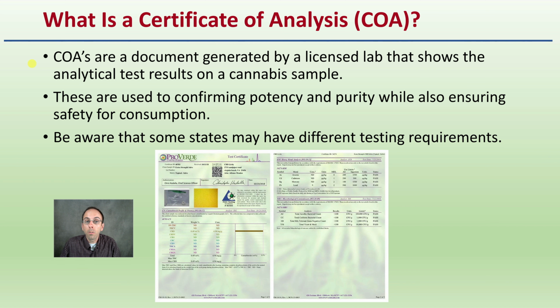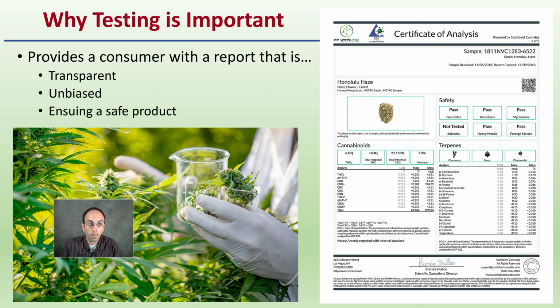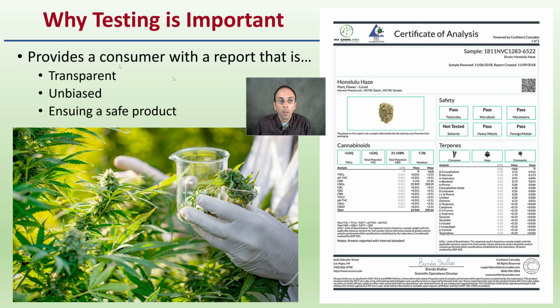These are used to confirm the potency as well as the purity, while also ensuring safety for consumption, and that's really important. Be aware that some states may have different testing requirements, and different labs may have different layouts, but for the most part, the generalness of what I'll talk about here will be applicable. So first off, why is testing important in general? Well, it provides the consumer with a report that is transparent, unbiased, and ensures a safe product in the end.